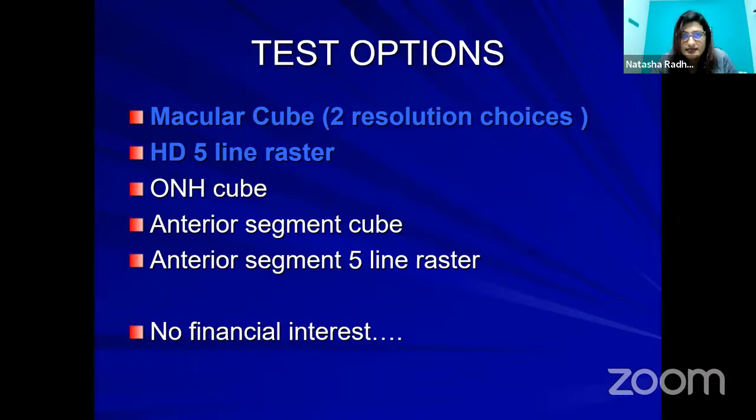I have no financial interest in this presentation, but my images are all from the Zeiss OCT. And mostly we will be dealing today with the macular OCT interpretation and not with the optic nerve head.